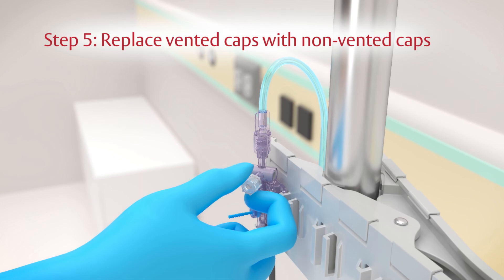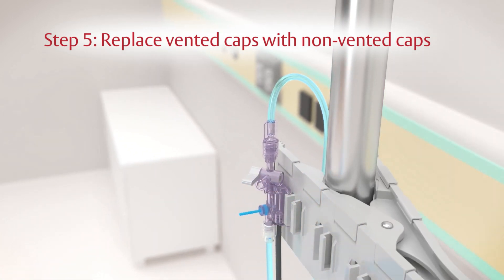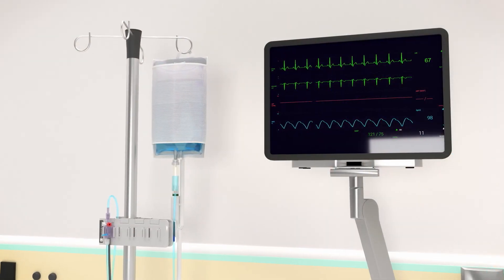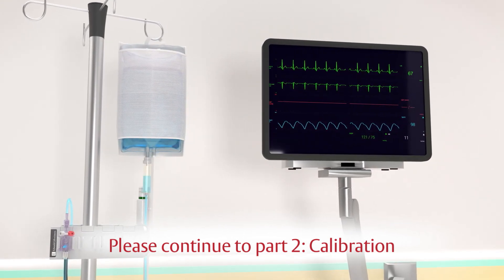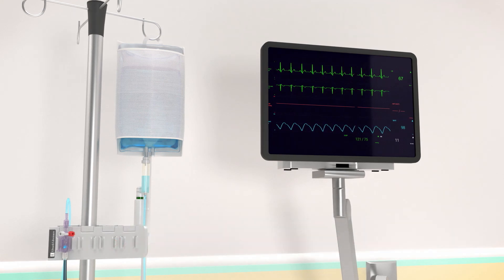Step 5: replace all the opaque vented caps on the side ports of the system stopcocks with non-vented caps. We have now completed priming the system. Please continue to Part 2 of this video series, Calibration, to complete the setup of the TruWave transducer with the bedside physiologic monitor.